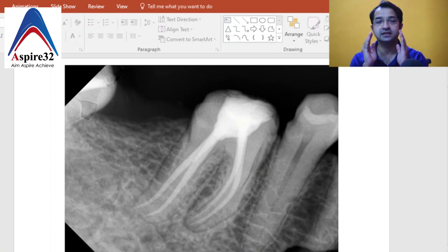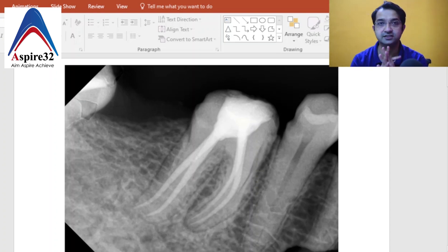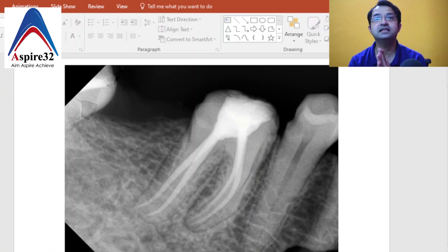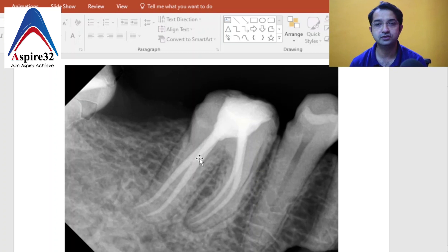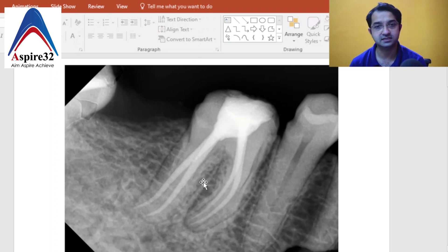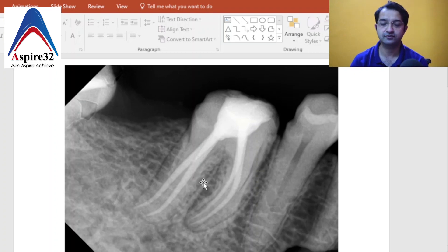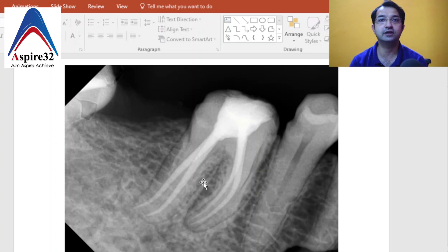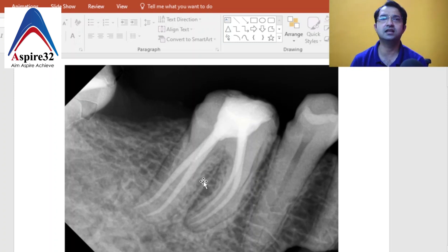I am going to explain a very simple alternative rule which can help you identify, remember, and treat cases better. This first X-ray shows a tooth where I have done obturation — two canals in the mesial root and two canals in the distal side. If you are a beginner or a UG student, looking at this X-ray you will find it very difficult to identify which canal is buccal and which is lingual.